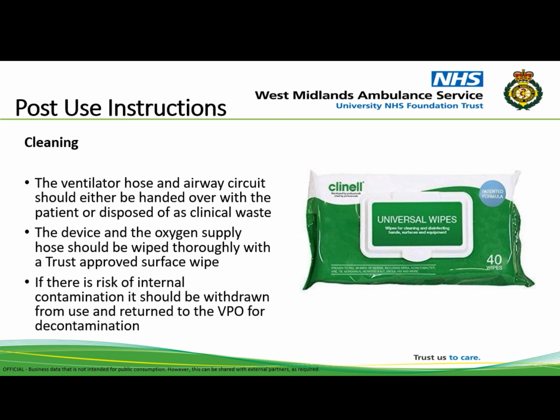Following use of the ventilator, the hose and airway circuit should either be handed over with the patient or disposed of via the clinical waste. The device and the oxygen supply hose should be wiped thoroughly with a trust-approved surface wipe. If there is risk of internal contamination, it should be withdrawn from use and returned to the VPO for formal decontamination.